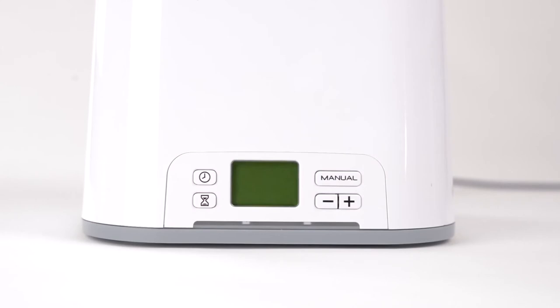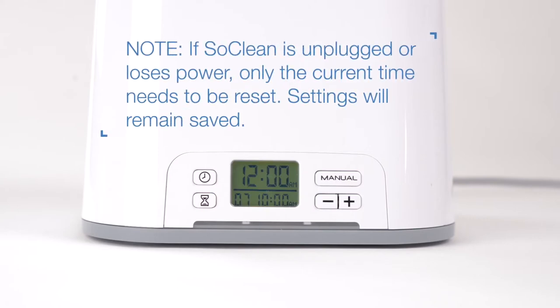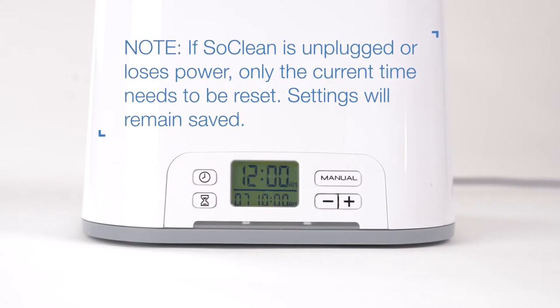Your SoClean 2 timer will allow you to completely automate your daily maintenance after connecting to your sleep equipment. The SoClean 2 comes preset to start a 7-minute cycle at 10am daily. However, you must set the clock to your current time. If you unplug the SoClean or experience a power loss, you will need to reset the current time only.